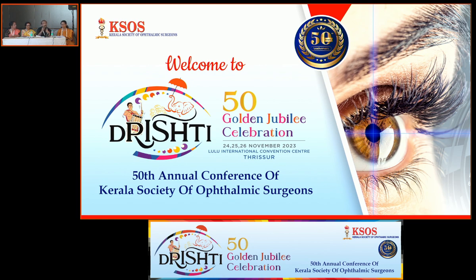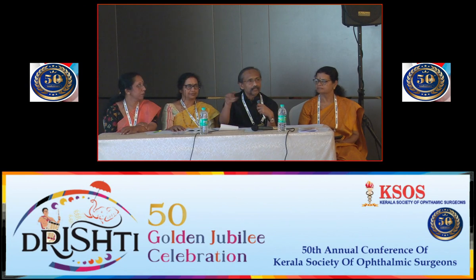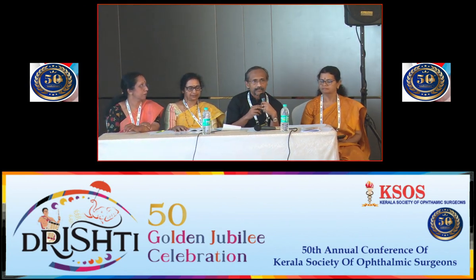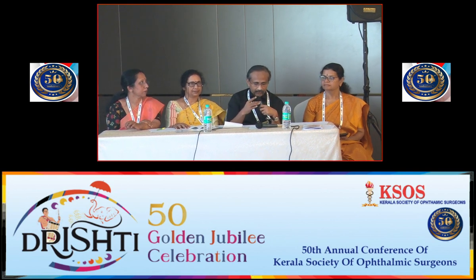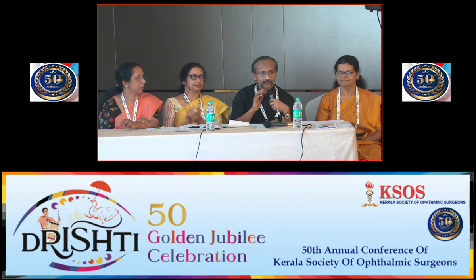Then you can proceed. And please, if you have multiple tonometers in your hospital, try in the same patient, in multiple patients, and see whether there is an error and that this needs to be calibrated. Otherwise, you should do a periodic calibration. Thank you. That was a nice one, actually. Basic, very important one, Dr. Mini. Thank you.